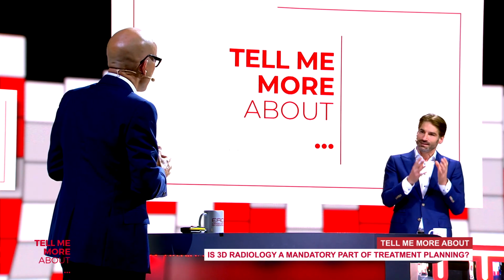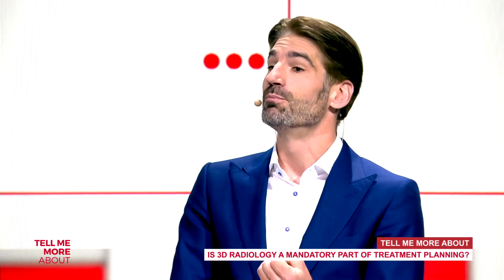First step, basics. 3D radiography is making a 3D scan of the patient, right? Absolutely. Compared to X-ray, I guess. That's where we come from in the past. The CBCT is three-dimensional, and in the past we used a two-dimensional panoramic view, and we started to use some measurement on the panoramic view, make some calculation to get the length, how much bone we have available. And today we can do this much more precisely.